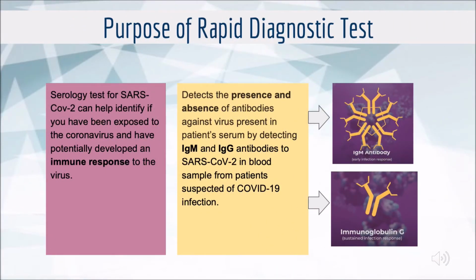What is the purpose of rapid diagnostic test? Firstly, what is serology? Serology is a scientific study of serum or plasma, especially with regard to the body's immune system response. Serology test for SARS-CoV-2 can help identify if you have been exposed to the coronavirus and have potentially developed an immune response to the virus.